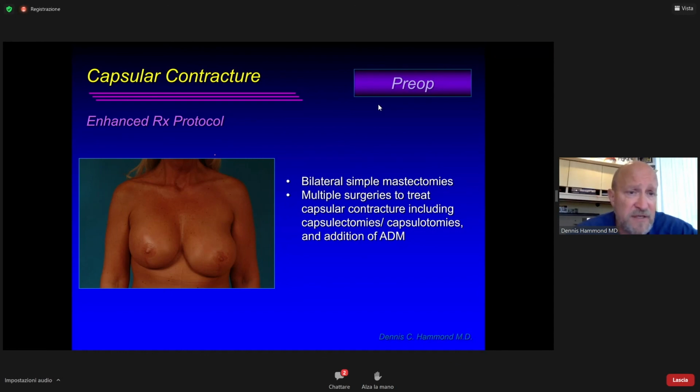There's just one last note here. Somebody said ALCL association with PU-coated implants is controversial, cannot state that as an absolute. Well, actually, I can state it as an absolute. I mean, ALCL is associated with polyurethane foam-coated implants. It's just not very common. And what the true incidence is really hard to say. Like I said, with Polytech, with their implants, they've only seen 3 cases.